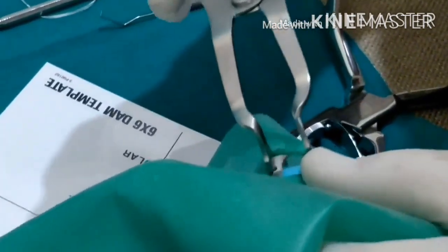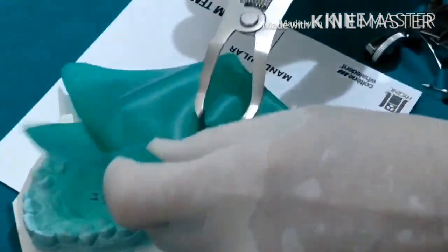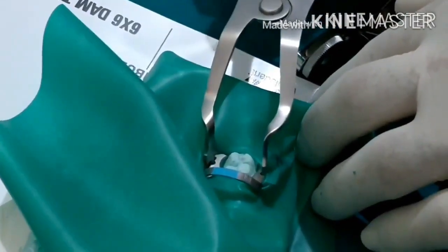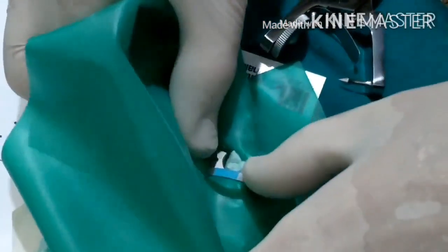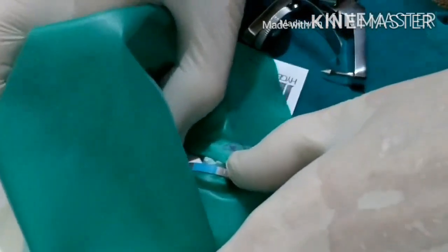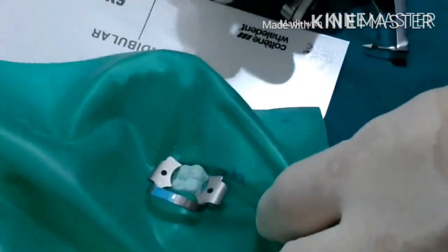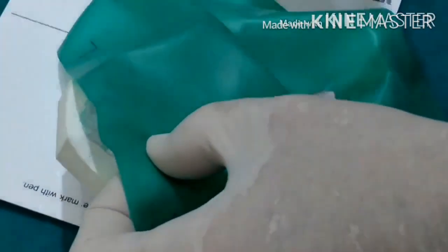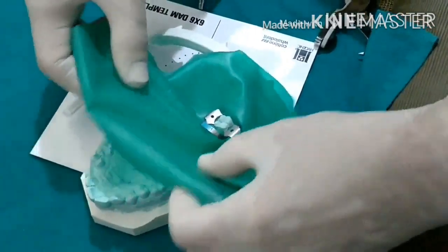Take the forceps, put them into the eyes of the wings, and in this case you can see the tooth and place the whole assembly directly onto the tooth. Slowly move it into position. The next step is to slip the rubber dam sheet down off the wings on one side and similarly down on the other side — and you have done your job. Then the rubber dam frame is fitted on and hooked the same way as before.